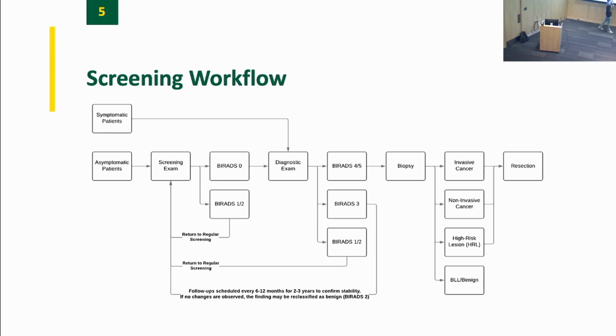Of those 40 patients, maybe about 5 of them get a BI-RADS 3. BI-RADS 3 means I see something I don't think is bad enough to biopsy, but I also don't want to image them in a year. I want to image them every 6 months for a few years to make sure the lesion's not changing. That's BI-RADS 3. And then about 30 to 35 will get a BI-RADS 4 or 5. They'll go to biopsy. Okay. If the biopsy is benign, then guess where they go?